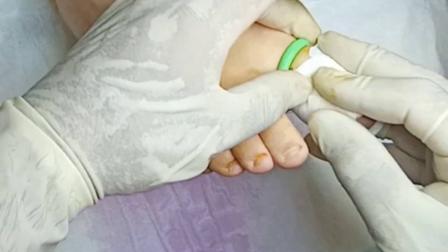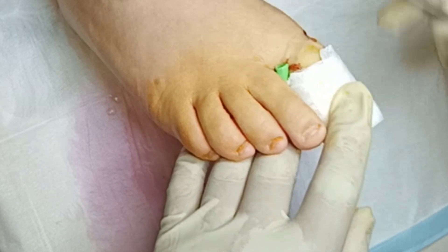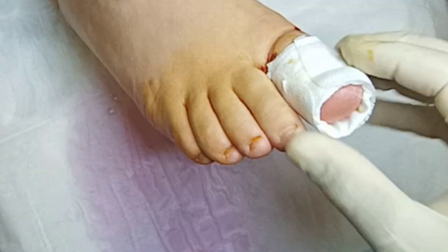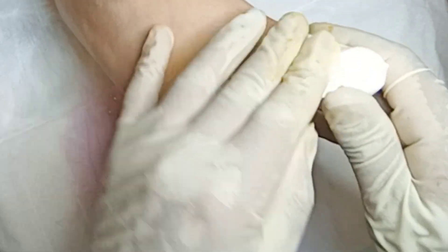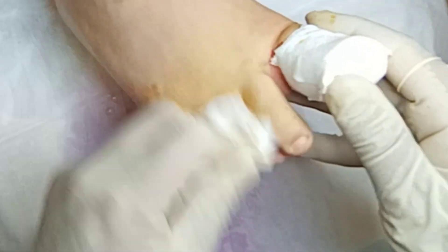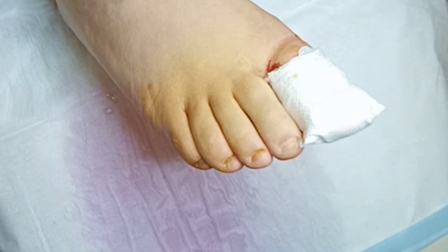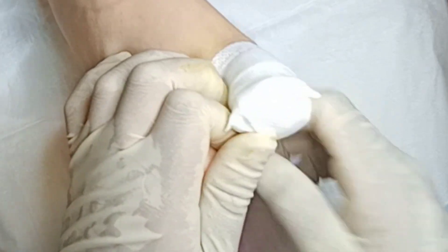There's the gauze going around, and this is the primopore — similar to Hyperfix, it's stretchable, but the padding provides a bit more absorption if there's any leakage. I'll go one around. I would have told the patient at this time, 'Hey, we're going to cut it off — have a look.' Off it comes. We mark the time it's put on and taken off too. Now I check — do we have bleeding coming through? I'm checking there: no bleeding coming through. I'll finish the dressing — one at the front to protect the toe, then another one around. We're not causing any constriction or affecting blood circulation because the material is stretchy.